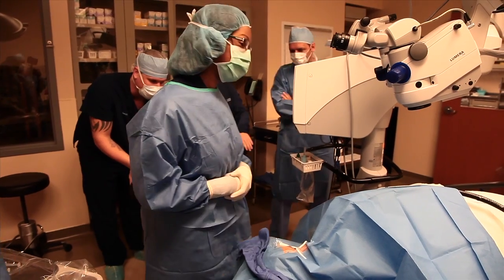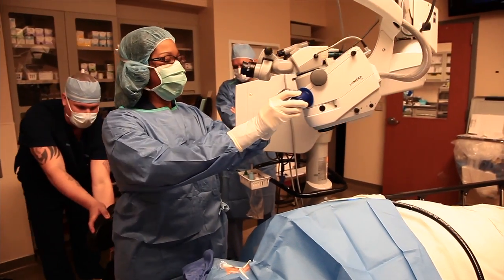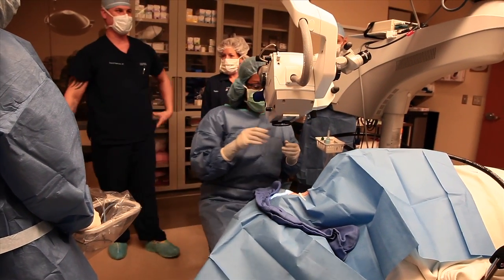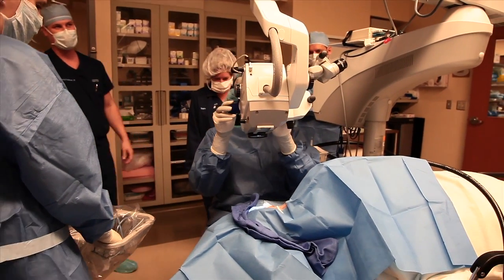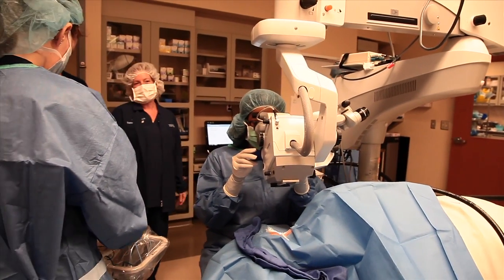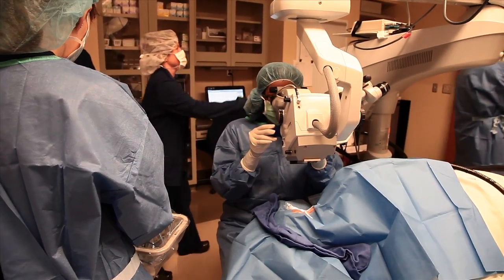I start with the patient's head position. So I sit temporally to the patient, depending on which eye the patient is having surgery on. And I will have the microscope tilted towards me. And then I will make sure that my oculars are in good position. And then I will take the patient's head and I will turn it away from me.